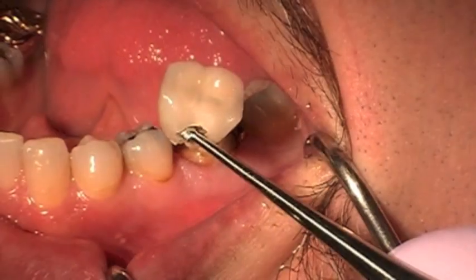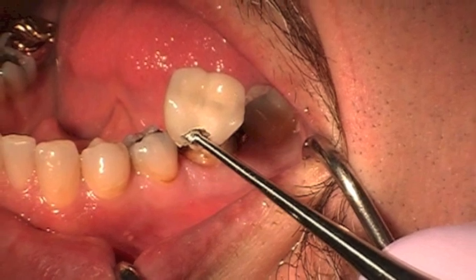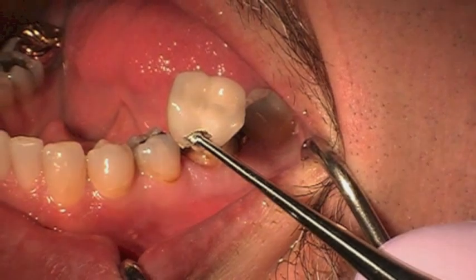I'm elevating and we're able to remove the crown without destroying it, without destroying the porcelain. I can actually use this as a temporary restoration.